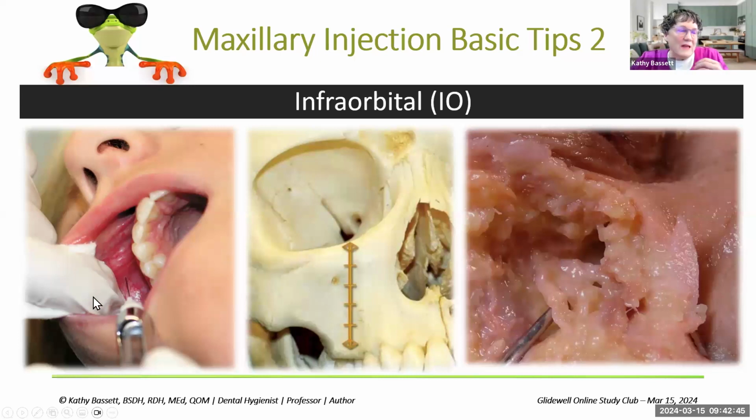And in this case, again, that retraction is important. Lift the tissue lateral versus folding it up so you clear that pathway. It's going to be just under the rim of the bone. And you hear people say, I don't want to go into the eye. In adult patients, this is very dense bone, and just keep in mind that the body protects high value assets.